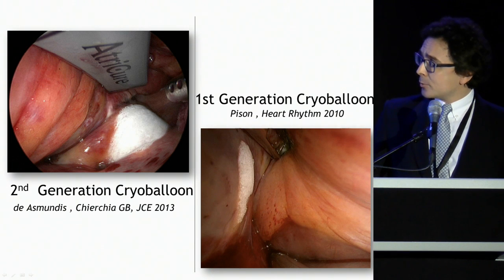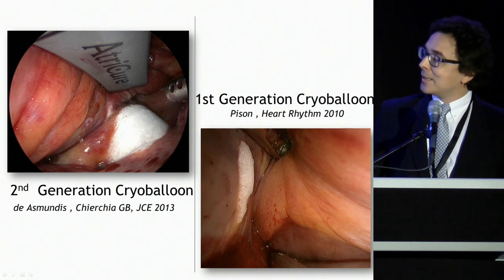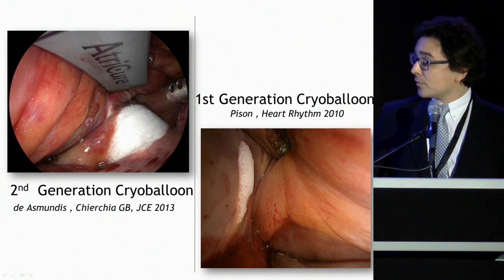This again is, well, I showed this because I've seen this morning that the Congress is mainly focused on epicardial procedures. Anyway, this was published by Professor Pison, who is currently busy with a very interesting case, and this is an epicardial view of an ablation with a first generation cryoballoon.